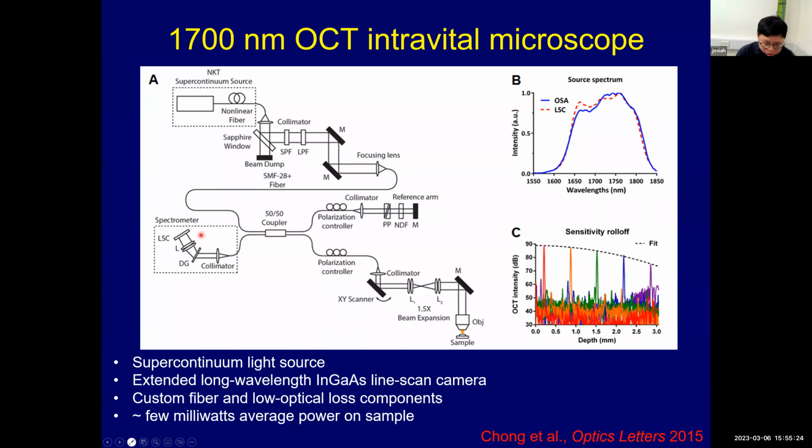This application requires a quite unique InGaAs line scan camera, and these cameras are usually quite noisy, unfortunately. They are not like silicon cameras.